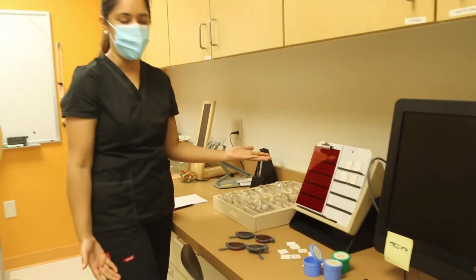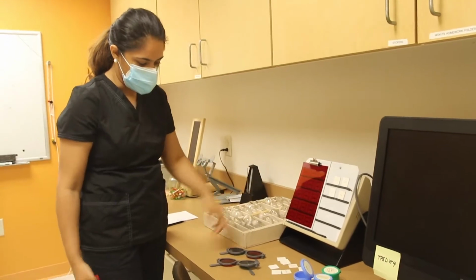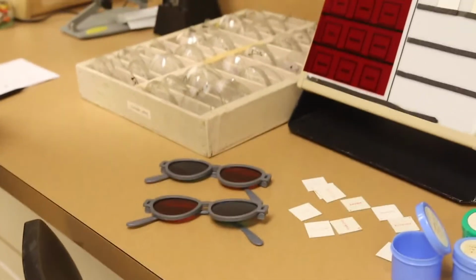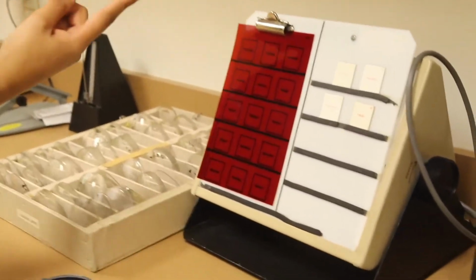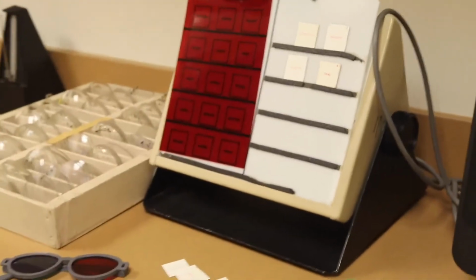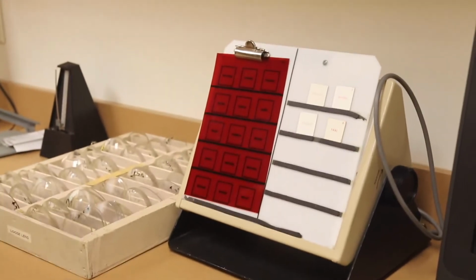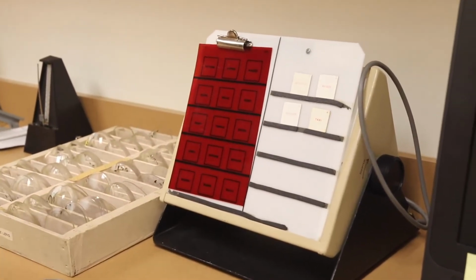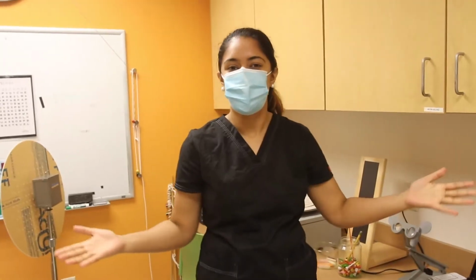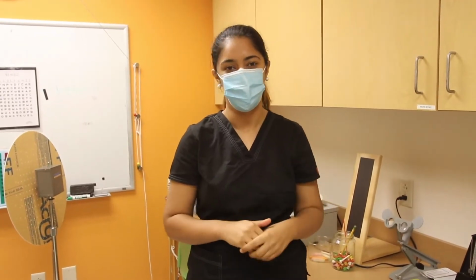It is also an activity we use in vision therapy, very, very cool. Basically, you can use these glasses to match all the tiles to the letters that they see. One of the eyes sees one of the tiles and the other eye sees one of the other letters. Again, we make sure that they're able to focus well together and that both of their eyes are working well together as well. Vision therapy is like going to the gym for your eyes, and this is one of the many activities that we do. So this was Vision Therapy Room 1, and we can now go over and check out the other rooms.